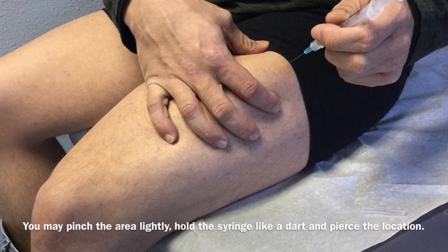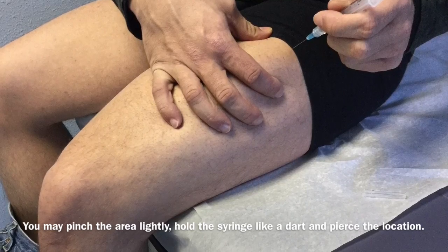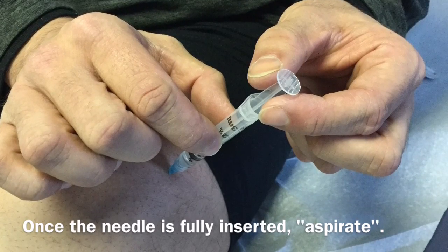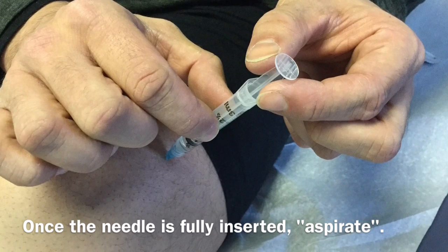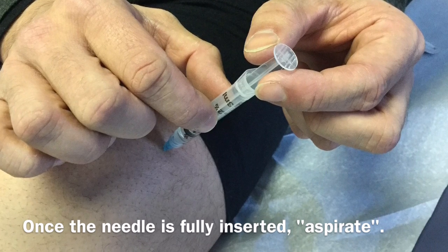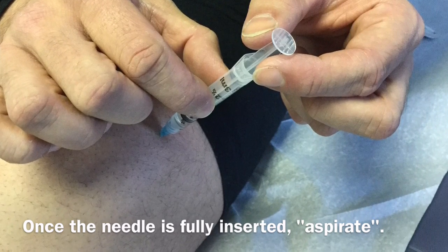Holding the syringe like a dart, and pinching the area slightly if you'd like to, insert the needle into the skin all the way up to the plastic hub — quicker is usually a little bit easier. Then you'll do what's called aspirating, which means pulling back slightly on the plunger. You're looking for any blood to come up into the syringe. If it does, that just indicates you've hit a blood vessel, which is not an emergency — it just means that you need to find another location to inject where you will just be injecting muscle. Aspirating and not hitting a blood vessel means that you're in the muscle, and all you should see come into the syringe is air.